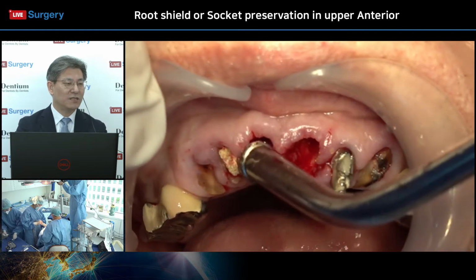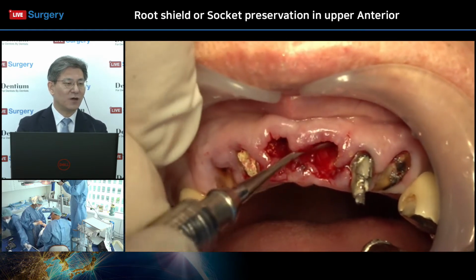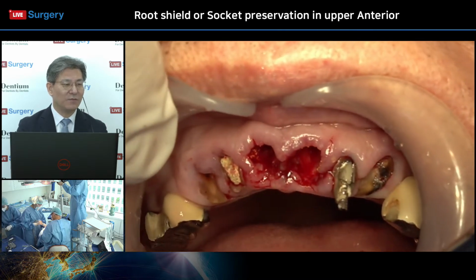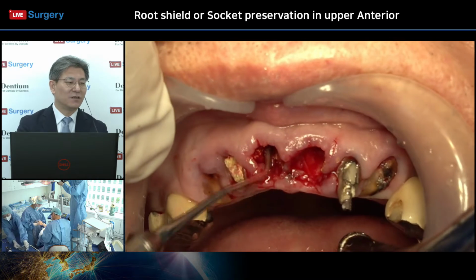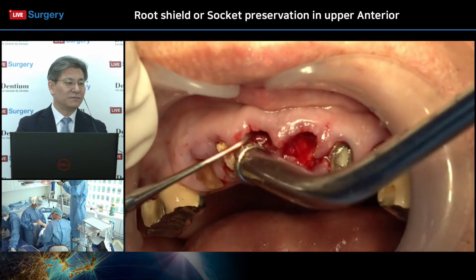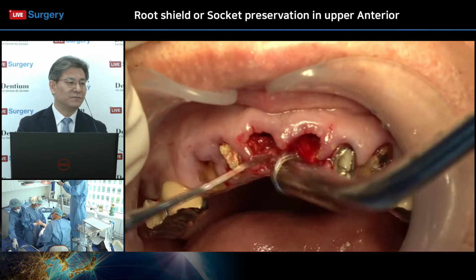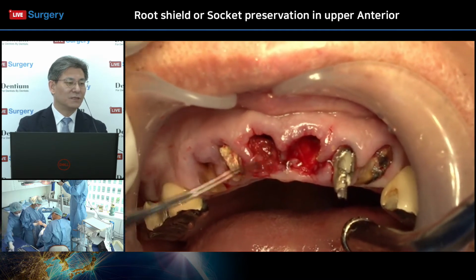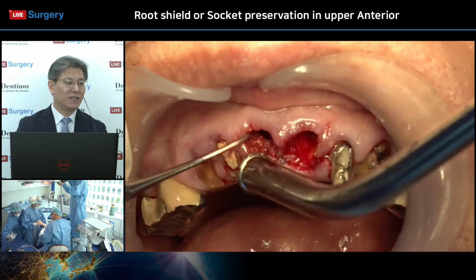Normally 4 minutes in the journal. In the article, the recommendation for this application time is 4 minutes. But we already used the laser, so in this situation, maybe a little bit less than 4 minutes, since we already used laser for detoxification.